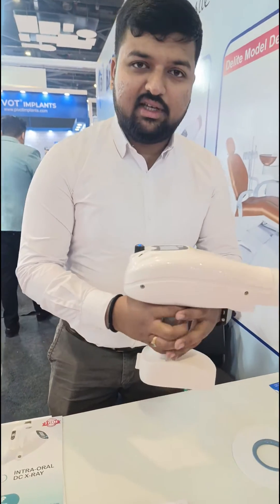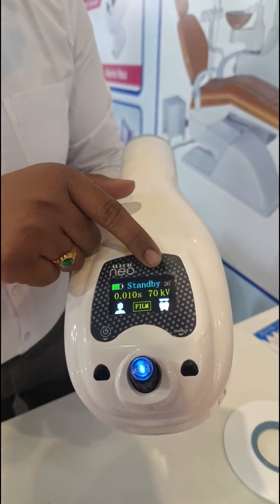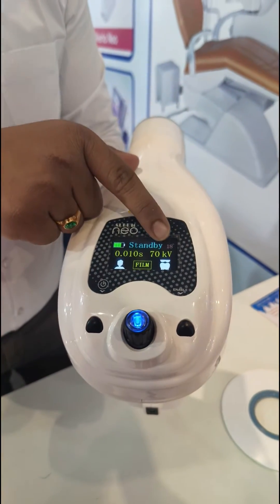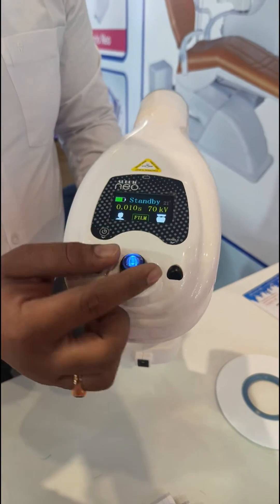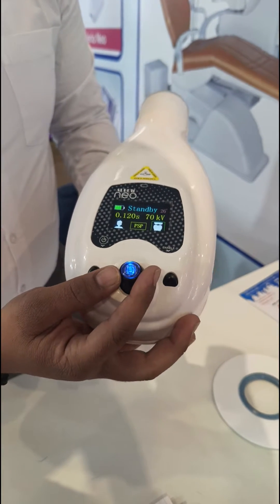Coming to the features of this X-ray — on the display you will have the battery indicator, angulation indicator, exposure indicator, and the kV indicator. Here you also have the adult and pedo option. This unit is compatible with three modes: film, digital sensor, and PSP.